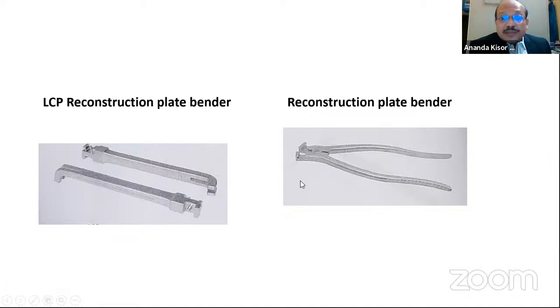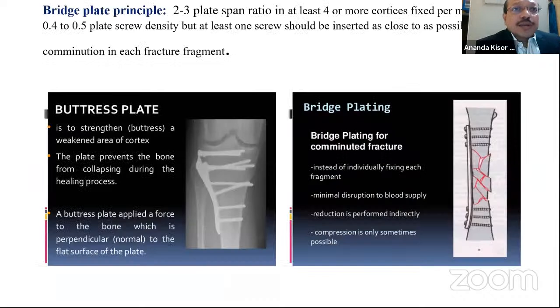This is the reconstruction plate bender. I will show you. The plate is placed over this, and once we widen its handle, that causes the bending.